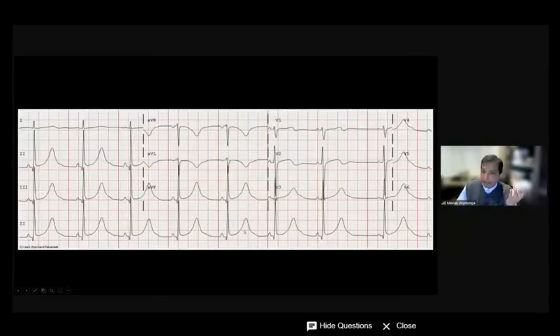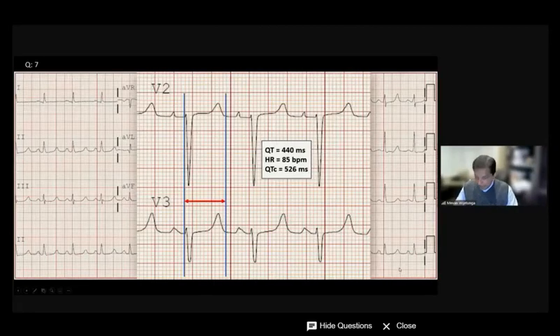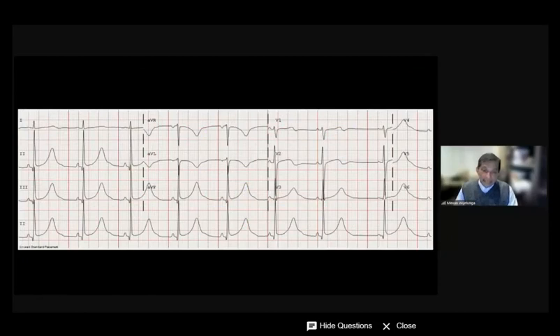And this is, of course, different. This is a patient of mine with congenital long QT syndrome, and obviously you can see the QT interval is very long. This is already over 600 milliseconds, over three boxes. In the previous patient, it was not that obvious, but I thought we should keep an eye on that, because it's something we easily miss day to day.